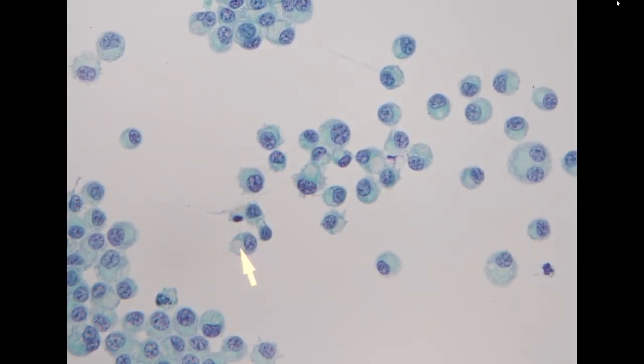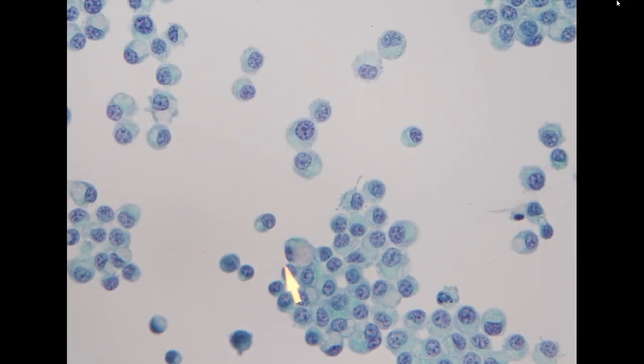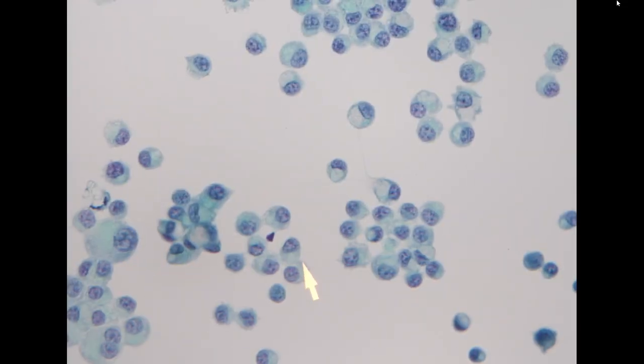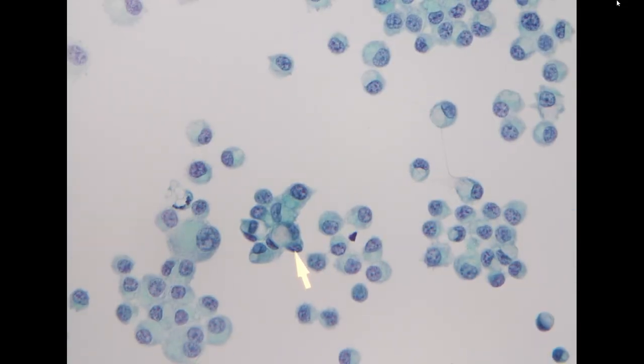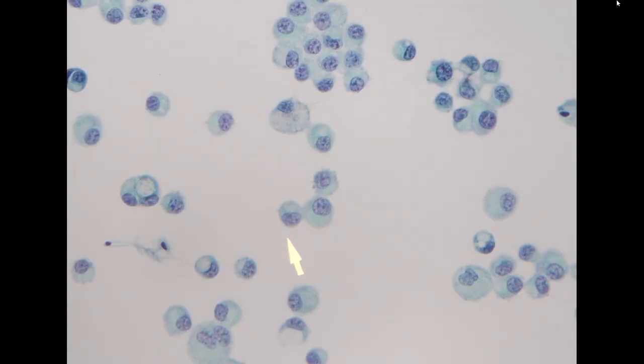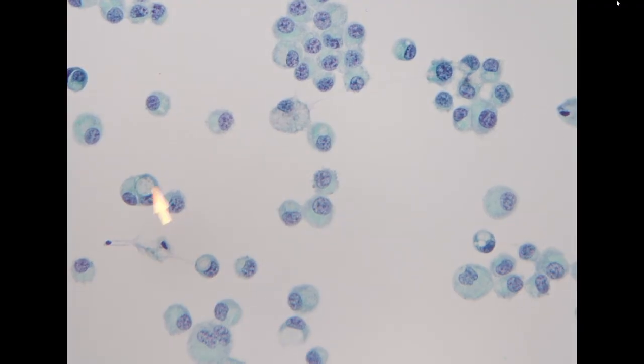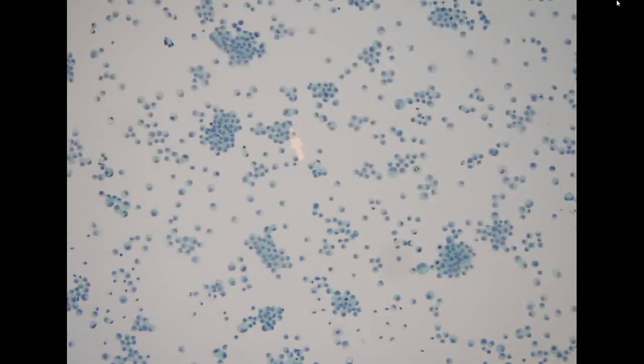You see it in here, and in here as well. So at first glance, I thought, okay, this is a plasma cell myeloma. But when you go on high power, you start to see mucin. You realize, okay, this is probably a signet ring cell carcinoma. The patient indeed had a history of gastric cancer. And this is a metastatic signet ring cell carcinoma from the stomach to the CSF specimen.